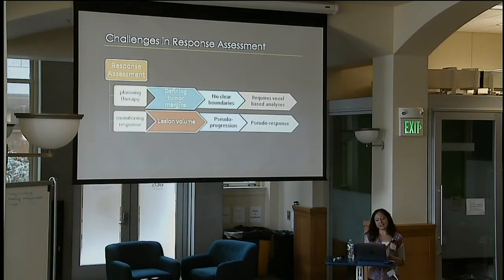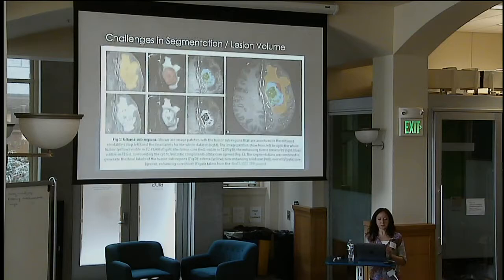And then the other component is monitoring response. We need good estimates of lesion volume, and also ways to recognize pseudoprogression and pseudoresponse. I'll explain in a minute what those refer to.